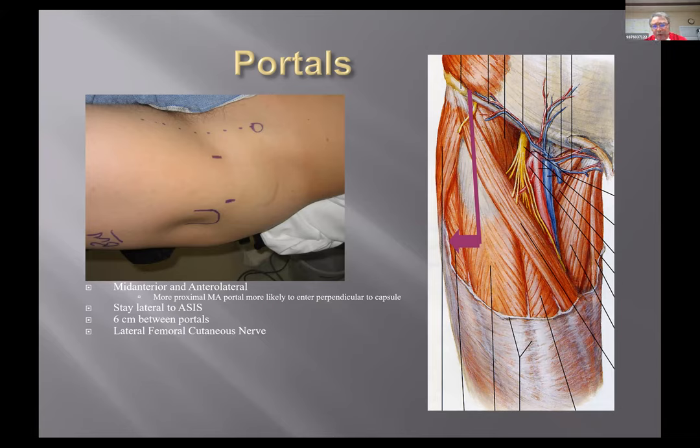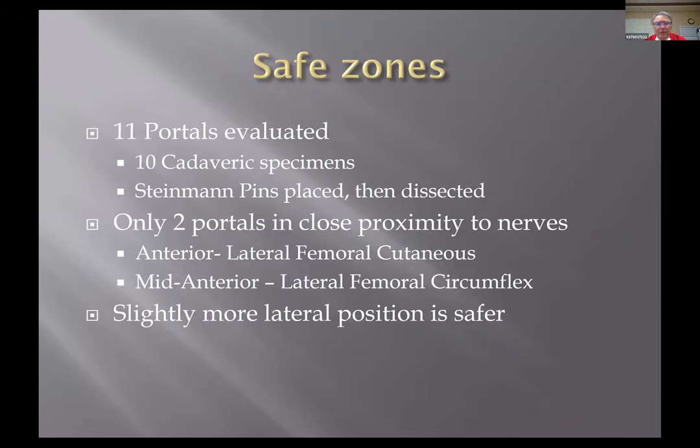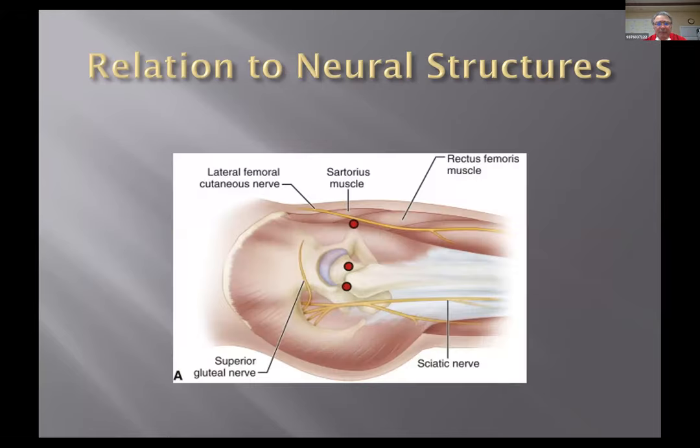Your working portals are your anterolateral and your anterior portal. And then there's a lot of accessory portals. Again, a lot of safe zones for this, a lot of other accessory zones. We're going to go into a few of these. The main thing is we're going to miss yellow things that are nerves. The most common nerve to get injured is going to be a branch of the lateral femoral cutaneous nerve. It arborizes laterally and gets closer as we get more anterior. The working portals, the anterolateral and the anterior portal, a modified anterior portal is the one I use more commonly. And then there are some distal portals for anchor insertion we'll talk about.